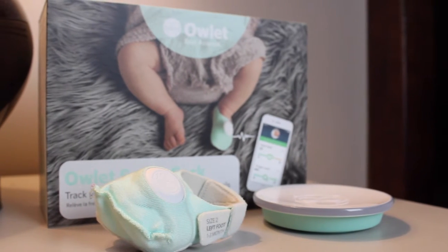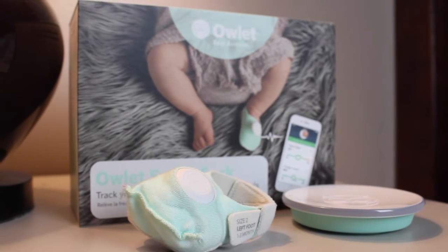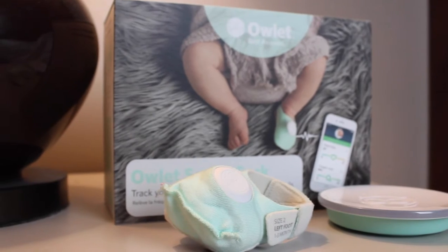I recently got in touch with the folks over at Owlet and they were cool enough to send me their smart baby monitoring system to try it out. Owlet did hook me up with the free system, but that is it. I was not paid in any way to give them some sort of outstanding review, so I'm going to be super honest with you folks in this video.